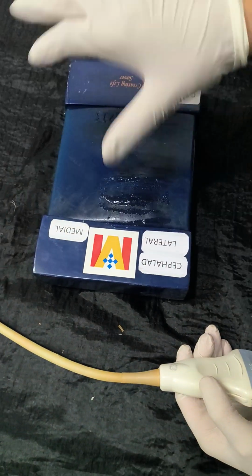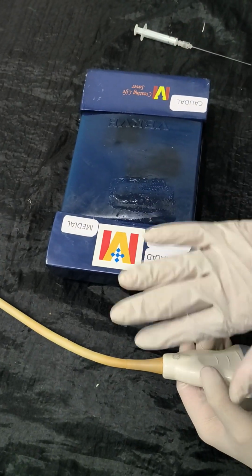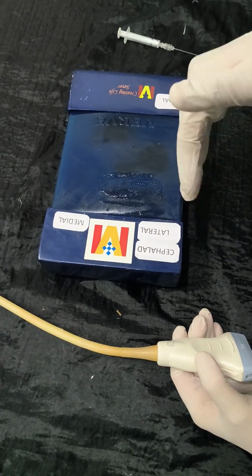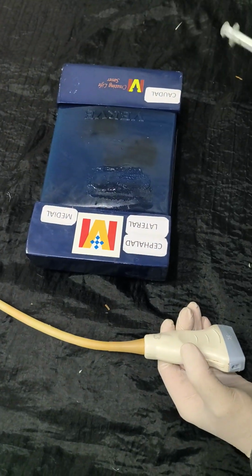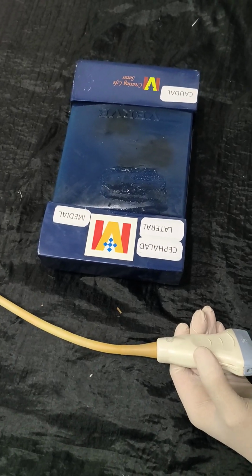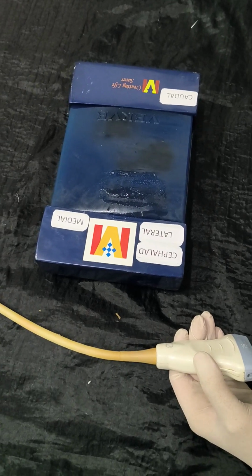So this is a work trainer. We have marked this like a patient lying supine, and this is the cephalad portion, this is the caudal, this is the lateral part of the body, and this is the medial part. Now what we are going to do is target practice. First of all, how to calculate the angle of the skin with the needle and your needle trajectory.